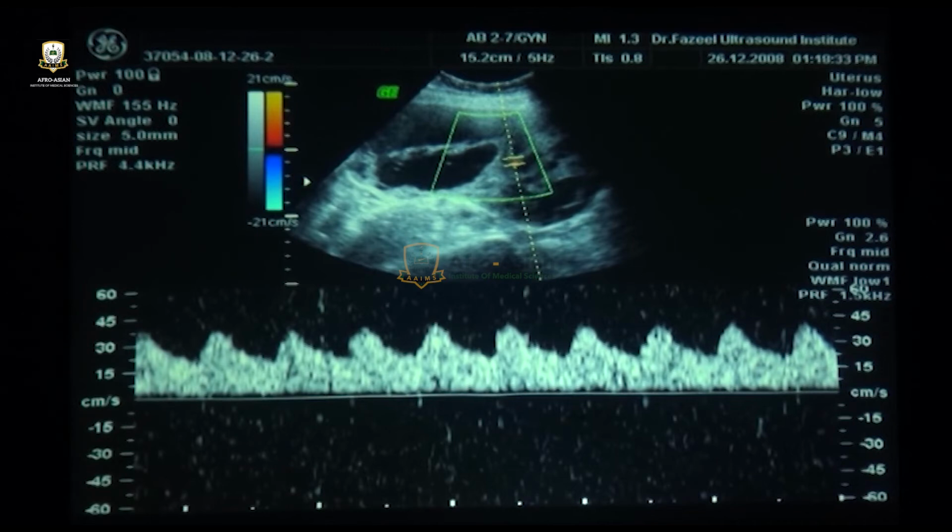Doppler blood flow shows the high diastolic blood flow because the tumor vessels do not have media. There is only intima and adventitia. So these vessels do not offer any resistance. So there is a good high Doppler velocity blood flow in the diastole.